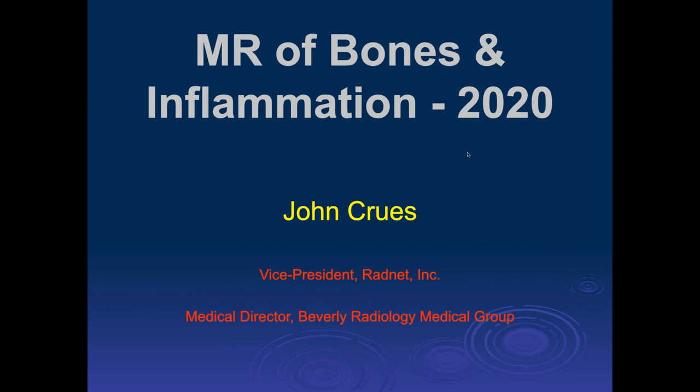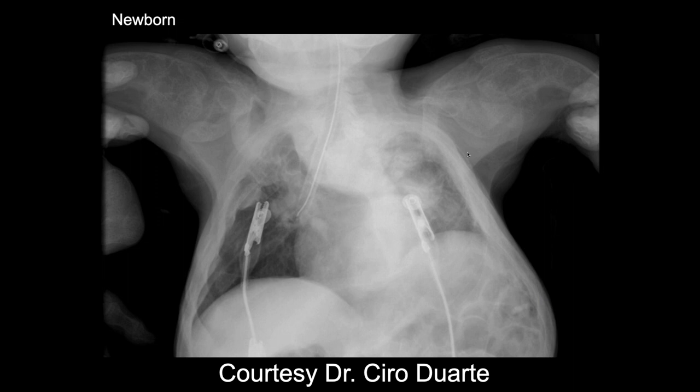Ashu, why don't you take this one? So this is a newborn. You can see there's extensive expansile lytic changes to the bones, especially the upper extremities. It involves mostly the humerus, but also parts of the scapula.